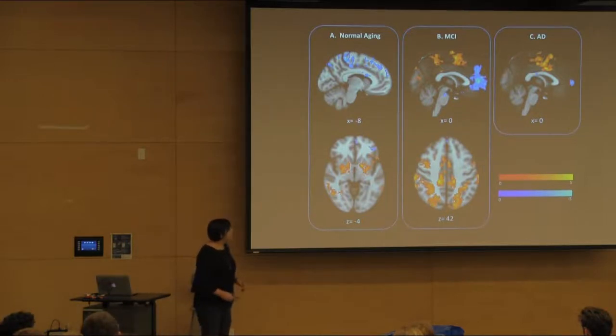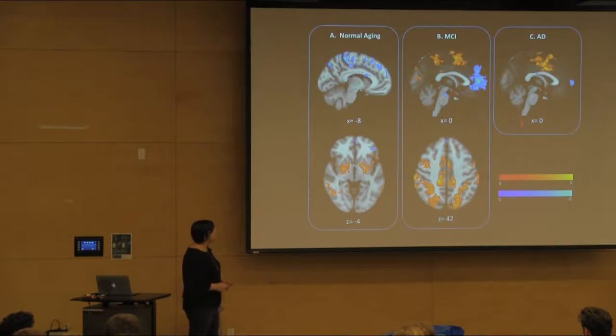And what is very interesting to me here is that in the mild cognitive impairment and the AD situation, what we see is that there's this increased connectivity, as shown by the red, to the default mode network PCC area, and decreased connectivity to the medial frontal wall. You can't see it as well here, but in all 3 conditions. So it seems to me that this anti-correlation we talk about with attention networks and default mode networks might just be more related to AD pathology.